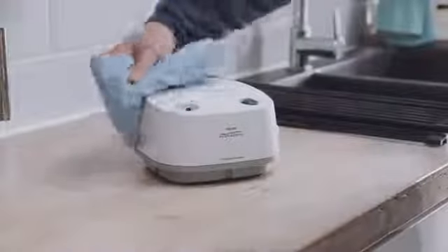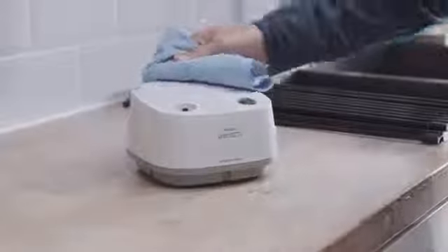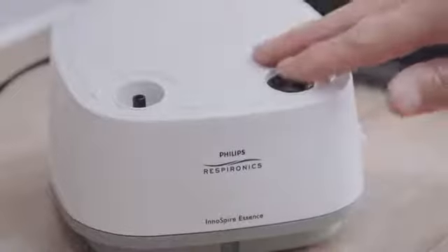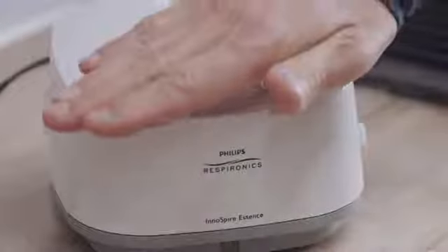Always unplug the unit before cleaning. The device can be cleaned by wiping down the outside of the compressor with a clean, damp cloth. Do this at least once a month. After cleaning, make sure the unit is working properly by checking that air still comes out of the nozzle when the unit is turned to the on position.